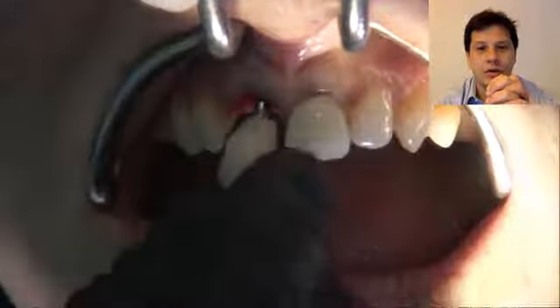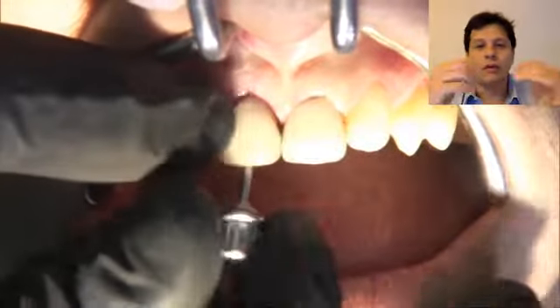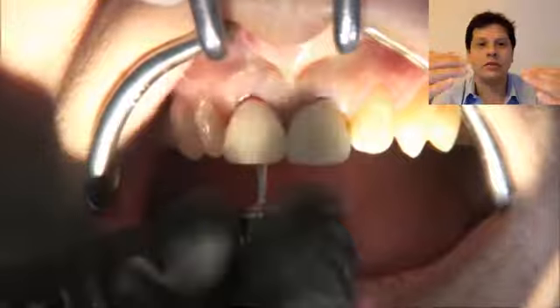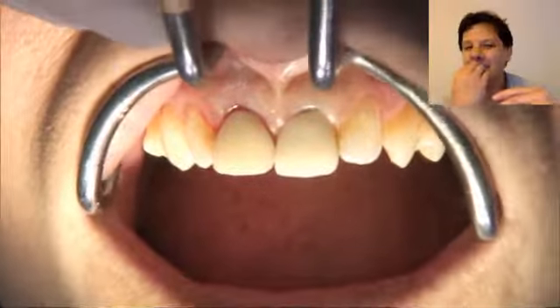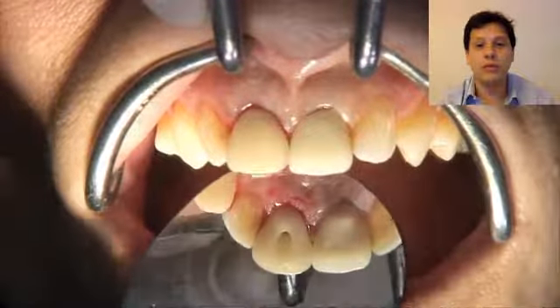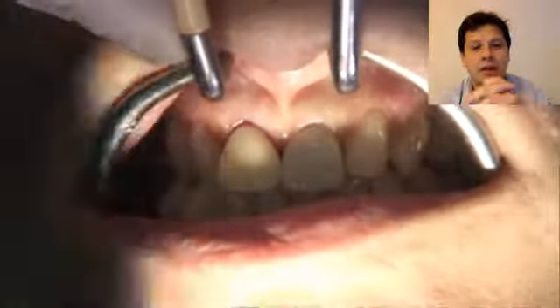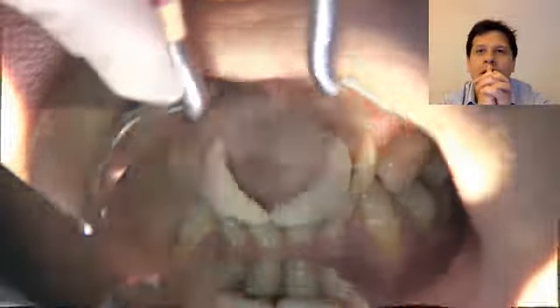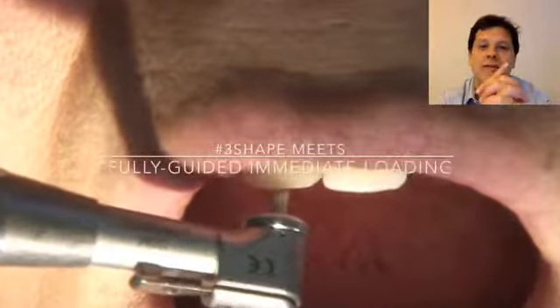So at the day of the surgery, here we go, we are ready to go, and so you just screw in. Of course, the crown will be shorter than the final crown, because this is immediate loading without occlusal contact. So you have to take out the guides so it doesn't touch in any eccentric movement. But now you see how quick and how fast the patient walks out of your office. So this is a protocol where we plan the provisional restorations beforehand.